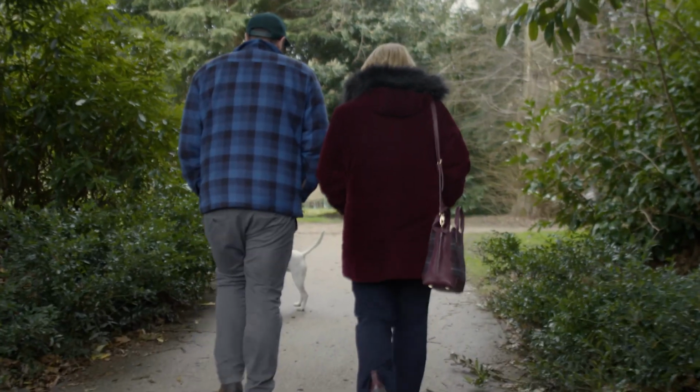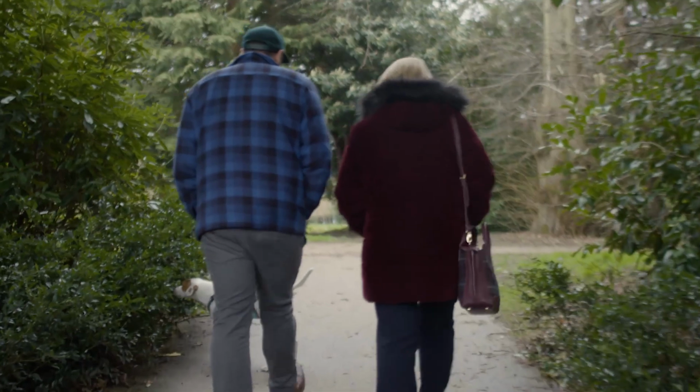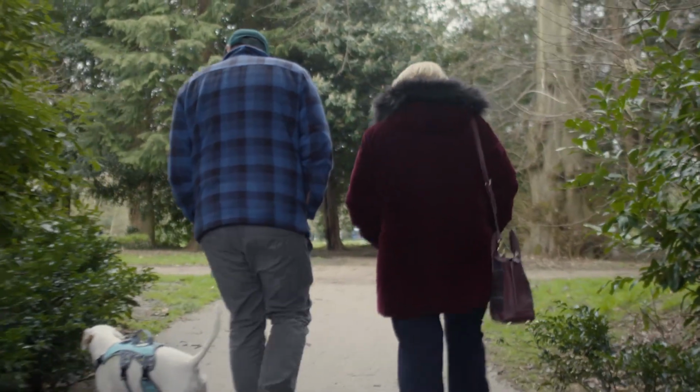The idea is that with a cochlear implant, you tend to get a better representation of high frequency sounds, whereas with a hearing aid like the Naida Link, you get potentially a better representation of the lower frequency sounds. So the benefit of that is with time, the brain can learn how to piece together those two parts.